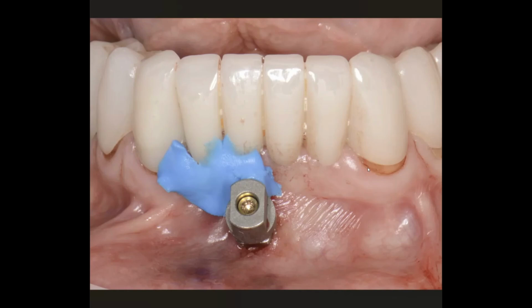And he came in and he said, "Whoa, whoa, whoa, you're doing this all wrong. It doesn't go there." I said, "No, that's exactly where it should go. That's the only place that it should go. Because when I put it in the midline and drop it down below the mandibular symphysis, it's going to be out of my way. I can do my surgery perfectly clean. I can remove all the teeth. I can place all the implants. I don't have to leave half a crown. I don't have to leave a canine. I don't have to have it in the way of my incision lines. It's going to be out of the way."